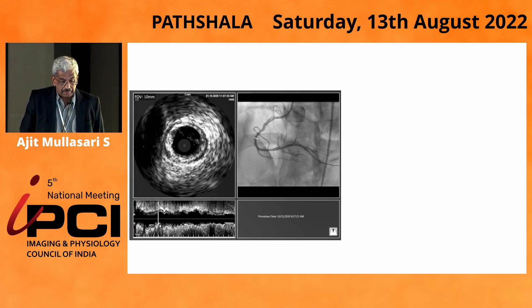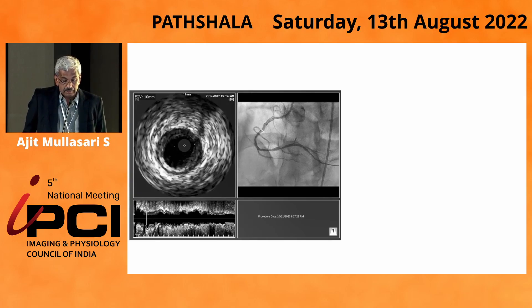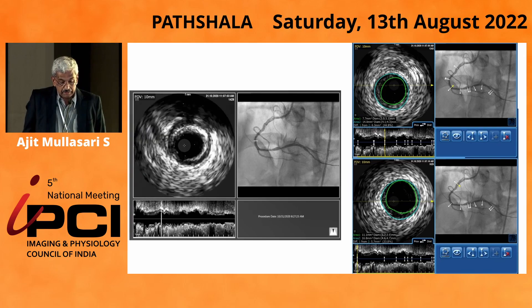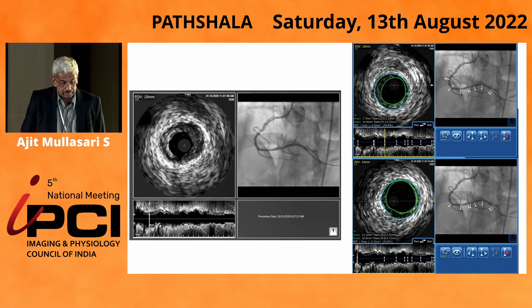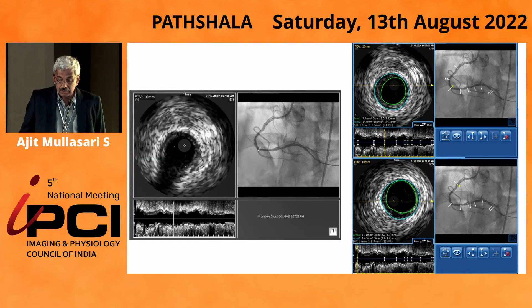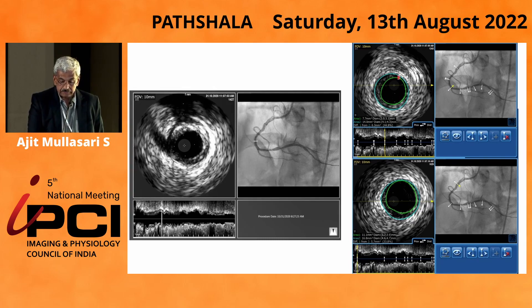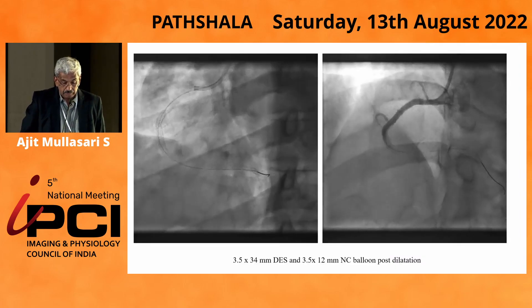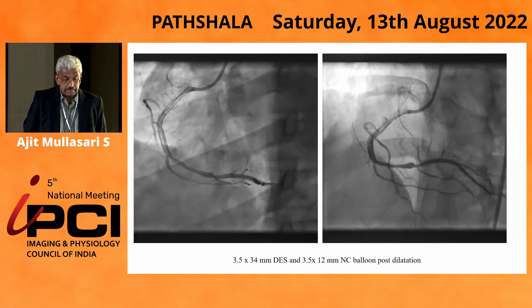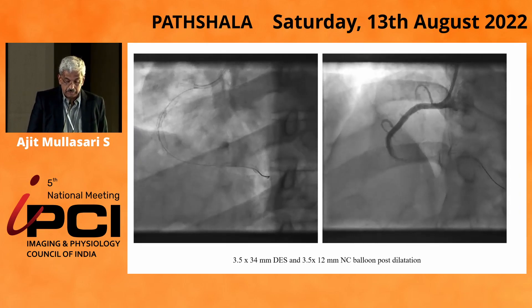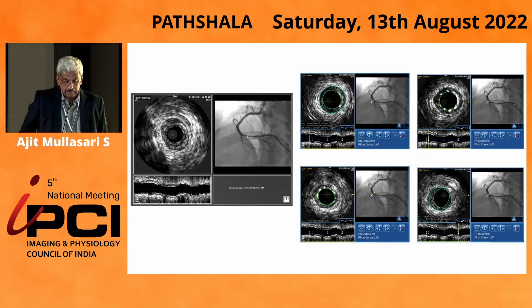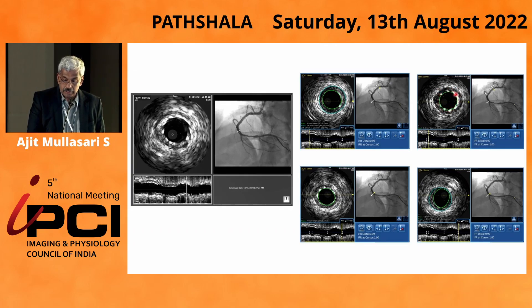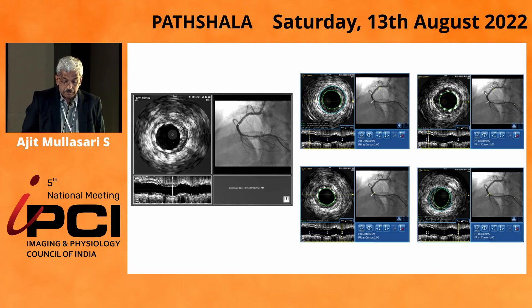We now do an IVUS pullback to size the vessel and the length of the lesion to fix that dissection. You can clearly see that what we need is approximately a 3.5mm size stent. You can see the lumens here and the proximal lumens to decide what size of stent is required. So we put a 3.5x34mm DES and then post-dilate with a 3.5x12 NC balloon. We again do an IVUS to check whether the lumens are okay, and now we have fixed that spot. The stent is okay; the proximal and distal lumens are okay.